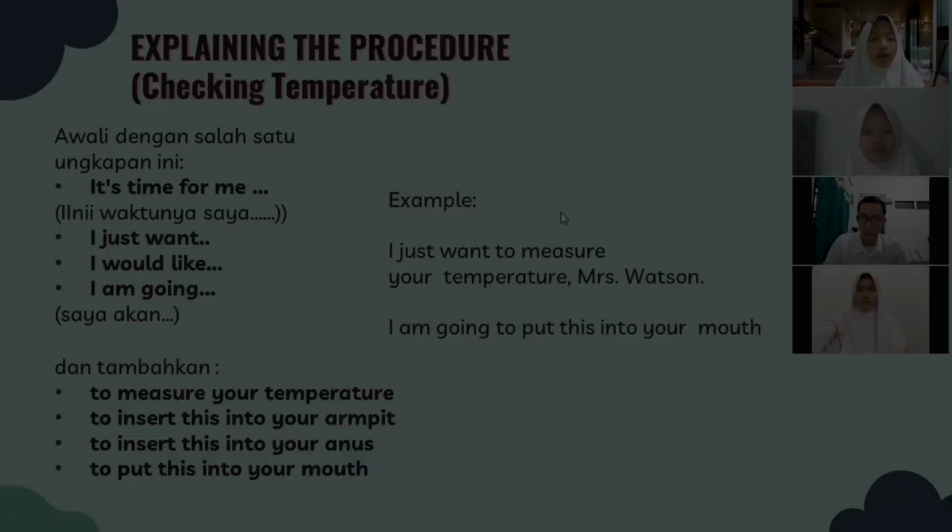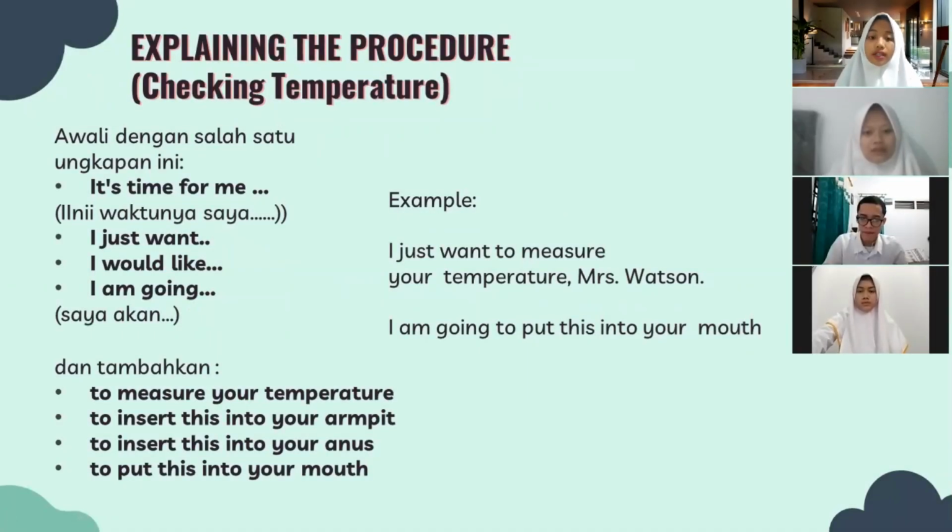You're welcome. See you. Okay, after you watch the video, here I will explain the temperature check. You can initiate the action with one of the following expressions. It's time for me, I just want, I would like, I'm going. And you can add an expression to measure your temperature, or to insert this into your armpit, to insert this into your anus, and the last one is to put this into your mouth.